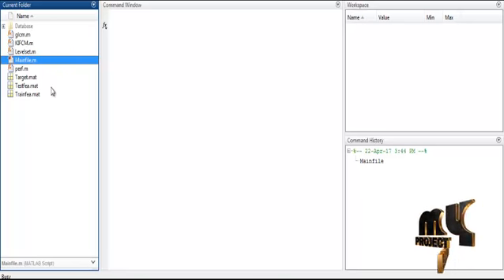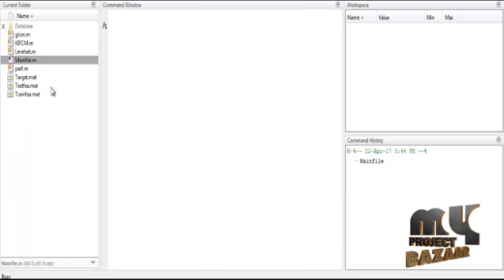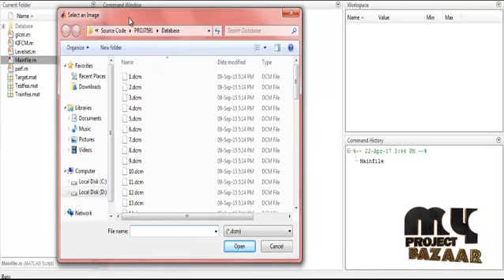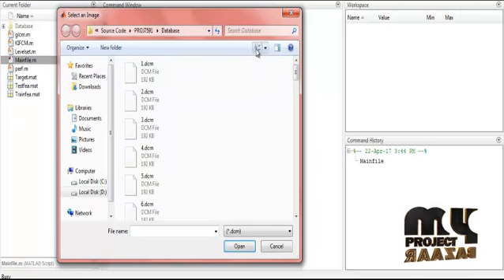So in this case, the software will open, and we will take the input image from the dataset. Then we proceed with the overall process: a pre-processing step, then clustering, segmentation, and so on. So now the input images will open. These are all the input images.